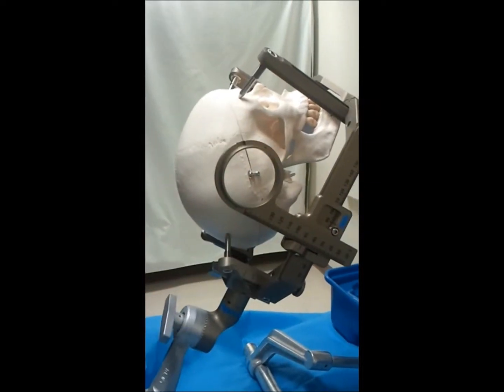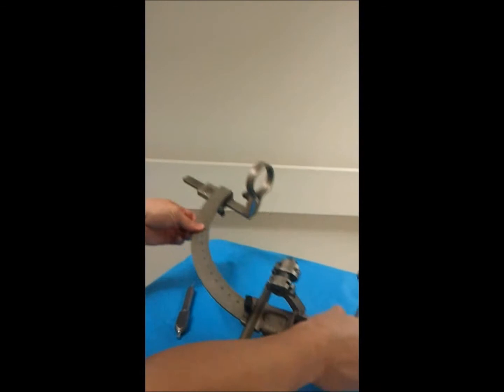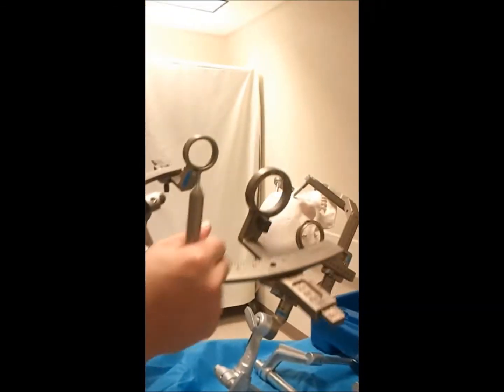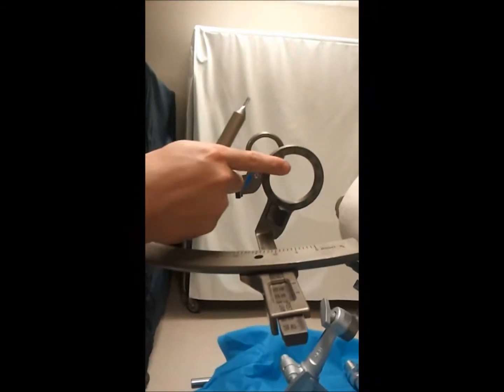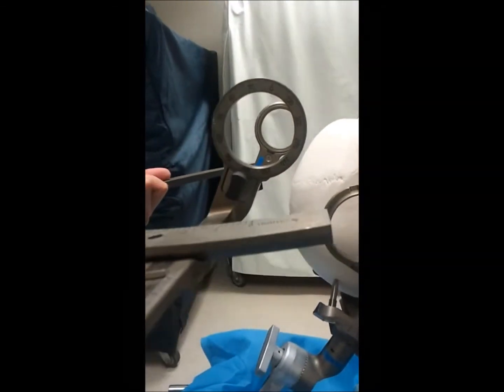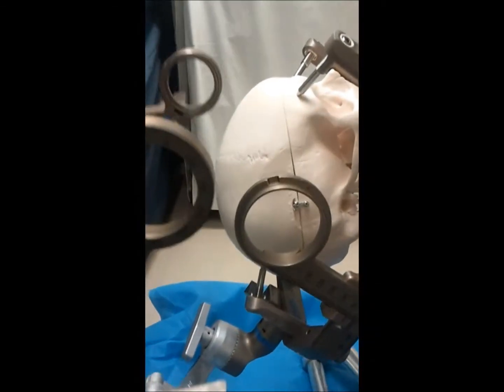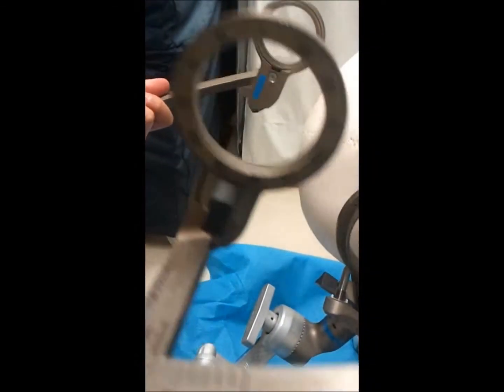the arc on. So the next portion of the procedure is to keep this instrument sterile and to get the ring. And so this is the portion I talked about as far as the numbers, and we'll adjust that ring number in just a second. If you notice, there's a notch here and a notch here which we'll have to line up. And what we do first is place the right side on.